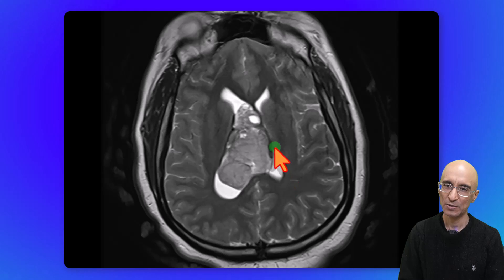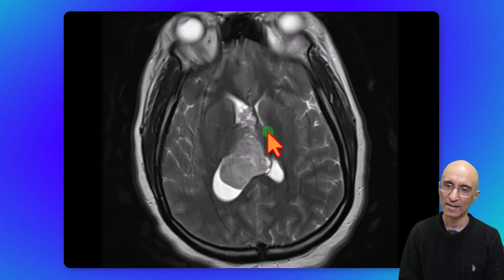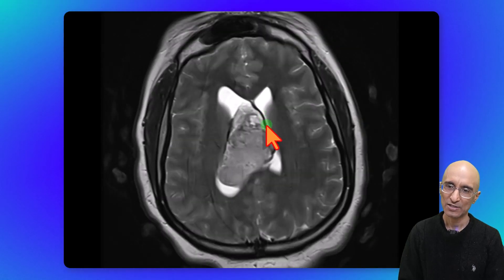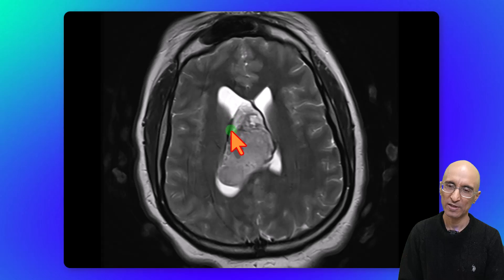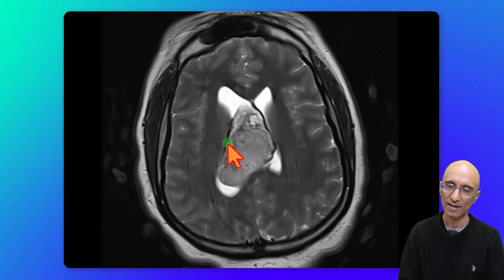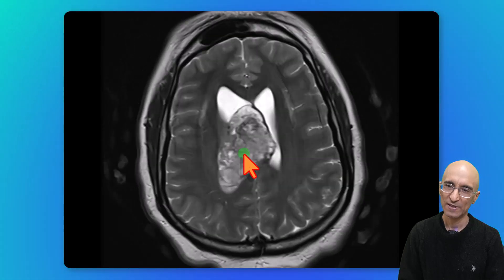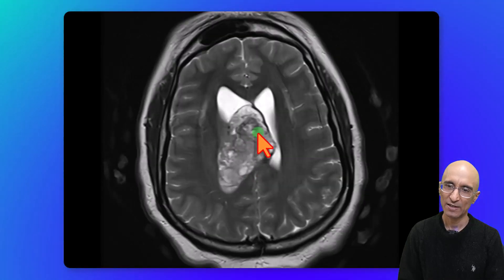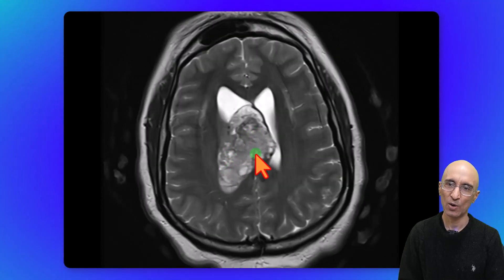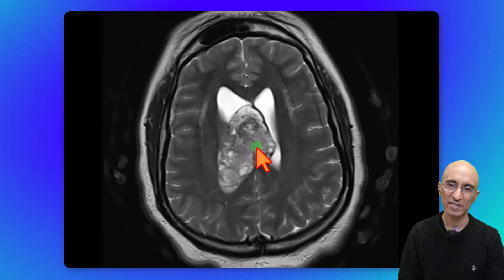On the axial T2 images, we can clearly see the mass attached to the septum pellucidum, extending up to the right lateral ventricle lateral margin. We can clearly identify the cystic foci within the mass, giving an appearance of soap bubble or swiss cheese.